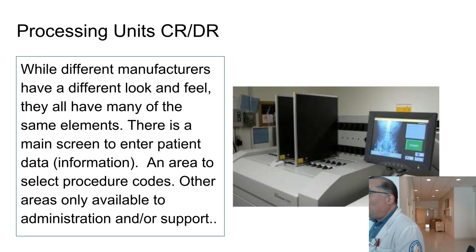We're going to talk about the lack of consistency when it comes to exposure indicators, and that manufacturers call them by all sorts of different names and they all have different ranges. We'll also talk about one way to try to standardize that, so across the board, everyone's using the same thing.